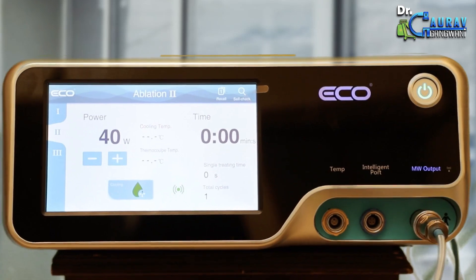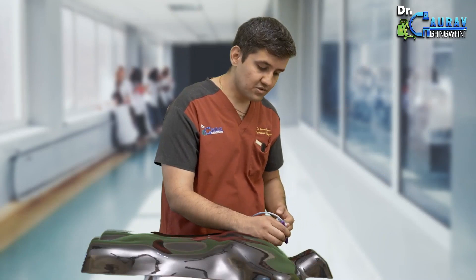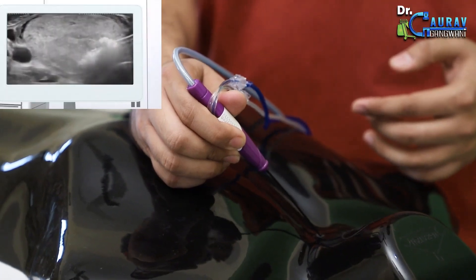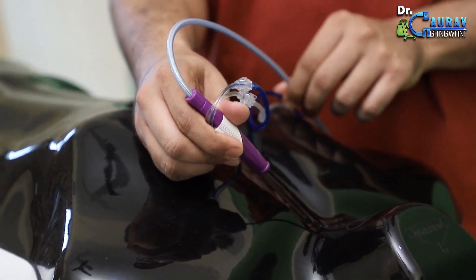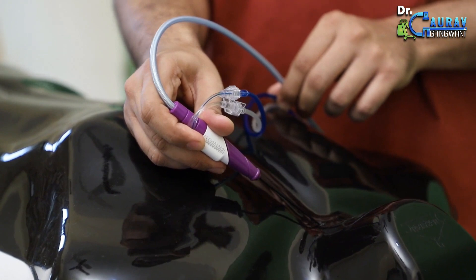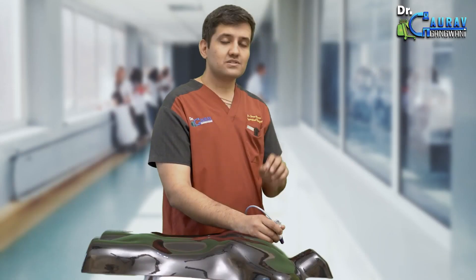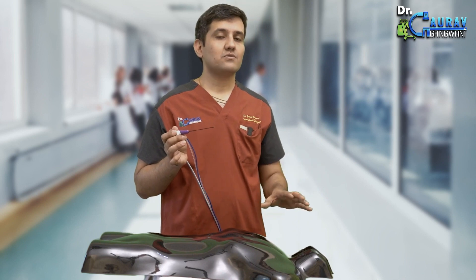I possess a foot pedal that enables me to initiate this in a controlled manner. I am about to commence that process, and the sound you are hearing is generated by the energy flow as the nodule gradually comes to a close. I will continue to change the position of my antenna while looking at the ultrasound so that I cover every area of the nodule — once the lower part is treated, I move to the upper part. When the sonography confirms the nodule is completely covered and no surrounding structure has been damaged, I can comfortably remove the antenna without any bleeding. Compression is applied for 10 minutes and the case is finished.